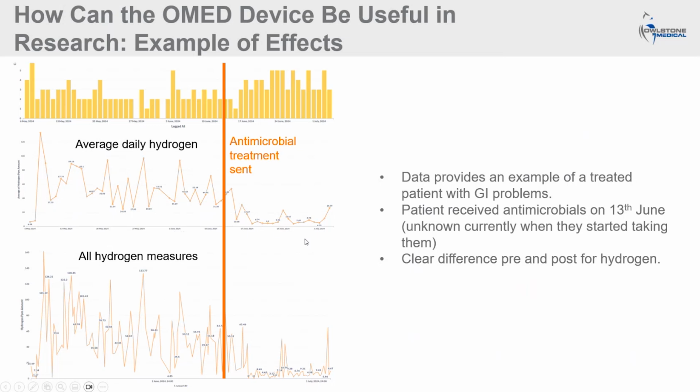This is potentially even more interesting when you look at all the hydrogen measures. So instead of averaging out the hydrogen per day, you're looking at all the hydrogen and methane readings taken.